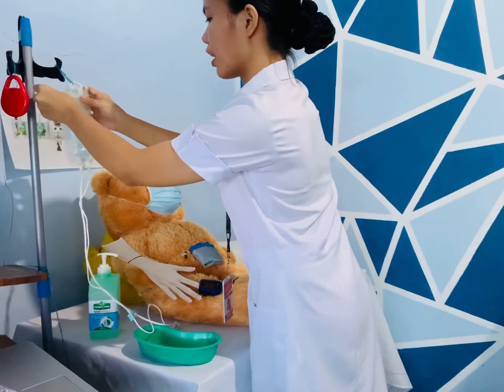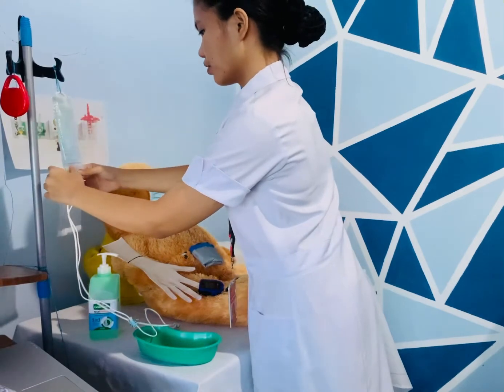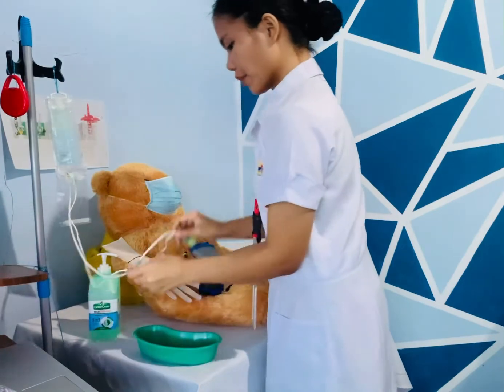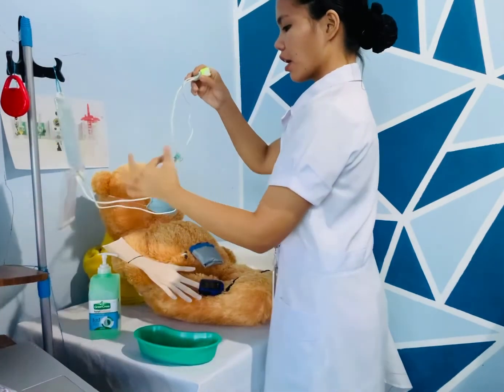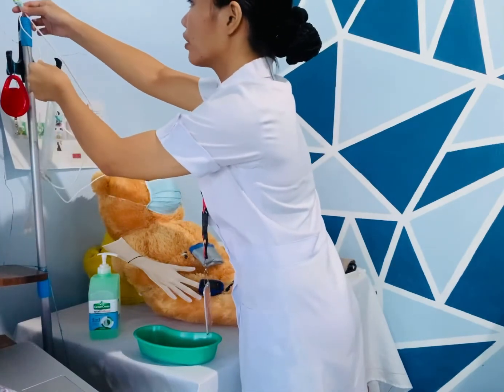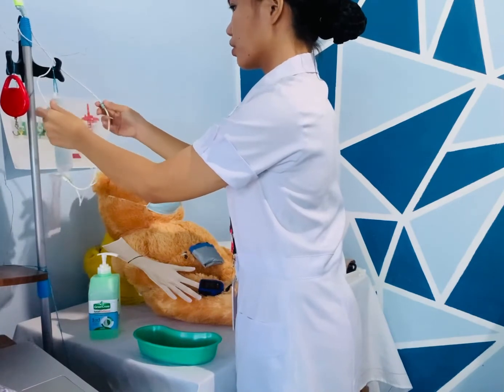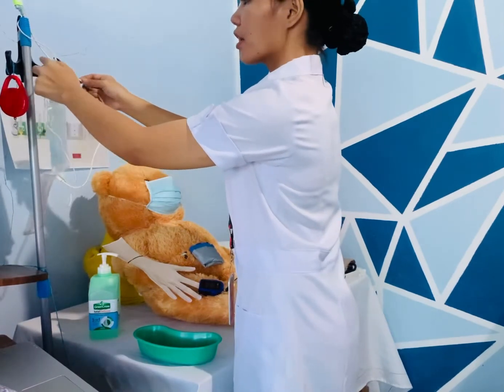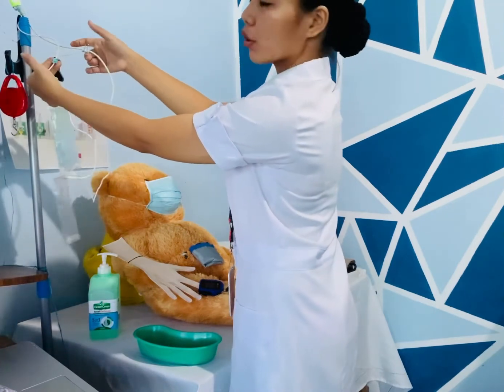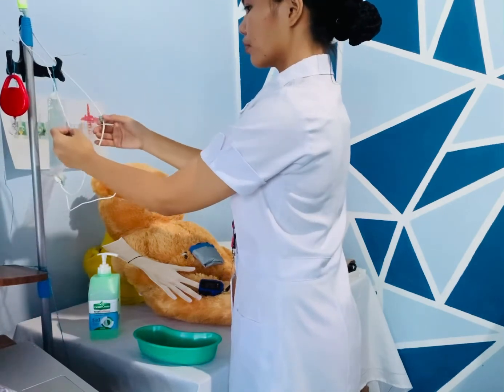Then separate the attached drain bag from the dialysis solution. Okay, and also separate the lines and hang the patient connector end on the drip stand. Okay. Then the next thing that I'm going to do is to pull both of the blue and white clamps down, then close them.